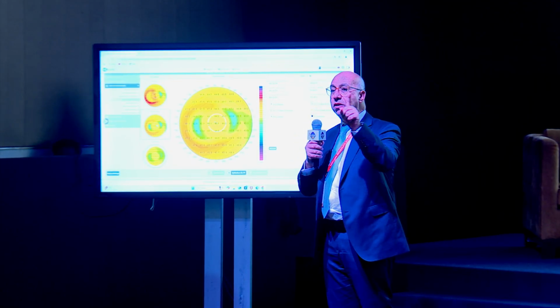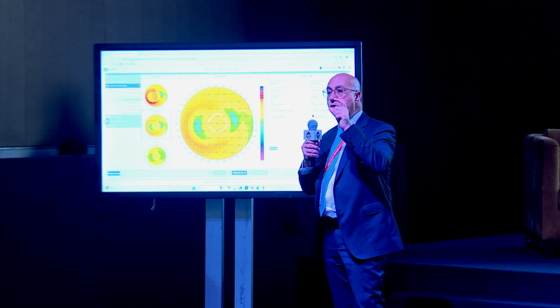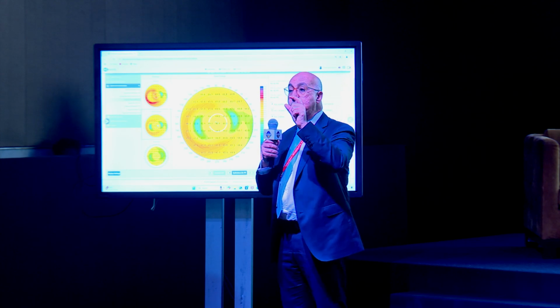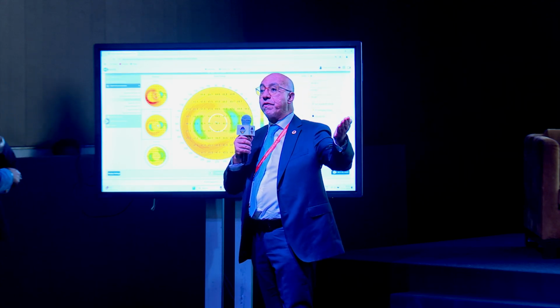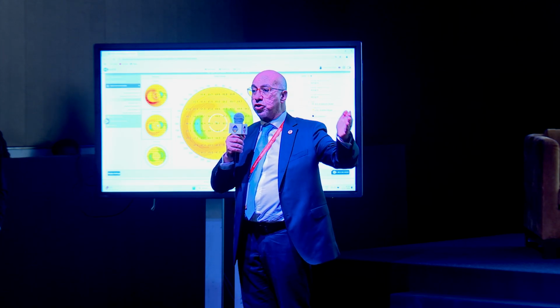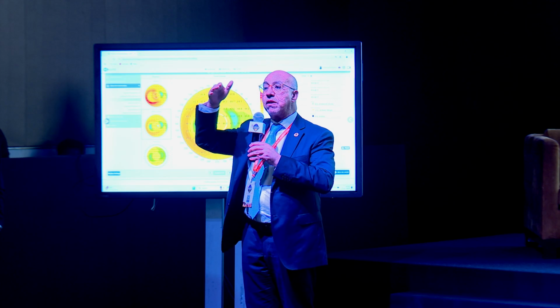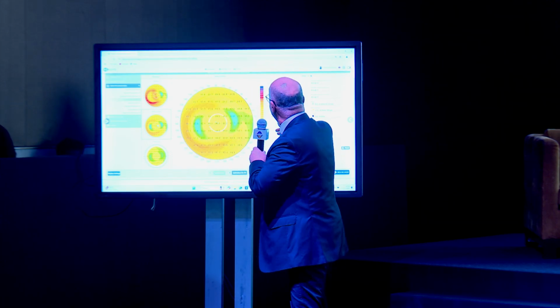And again, you don't need any large pupil for that, because we have been taught from the Stiles-Crawford effect that the central 2 to 3 millimeters are the most important. So what makes the classical teaching of refractive surgery have such a big refractive zone and transition zone? Simply the knee, the transition between the refractive zone and the optical zone, was just so abrupt. But now we are playing with the gradient.